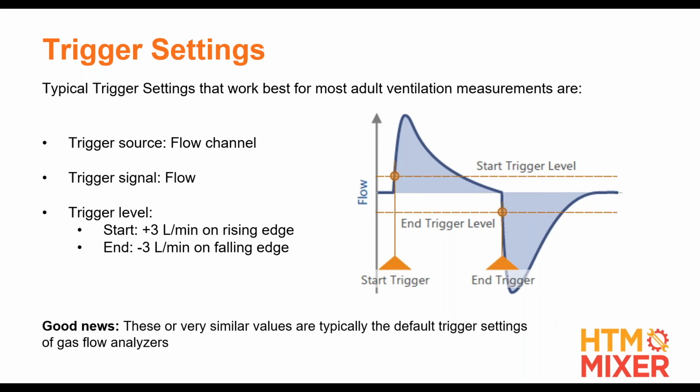It's true, because if your test lung is very bouncy or loose, like a worn-out balloon where the band is gone off of it, you're going to get some terrible signals. And it's not the ventilator's fault, it's trying, it's just that your test lung is not doing a very good job, right? So you'll have noisy signals, and when you do, a lot of times you can look and see what that waveform looks like, and then you can adjust your trigger values to take care of that until you can get a new test lung, right? So we do have default triggers, and they take care of most things.